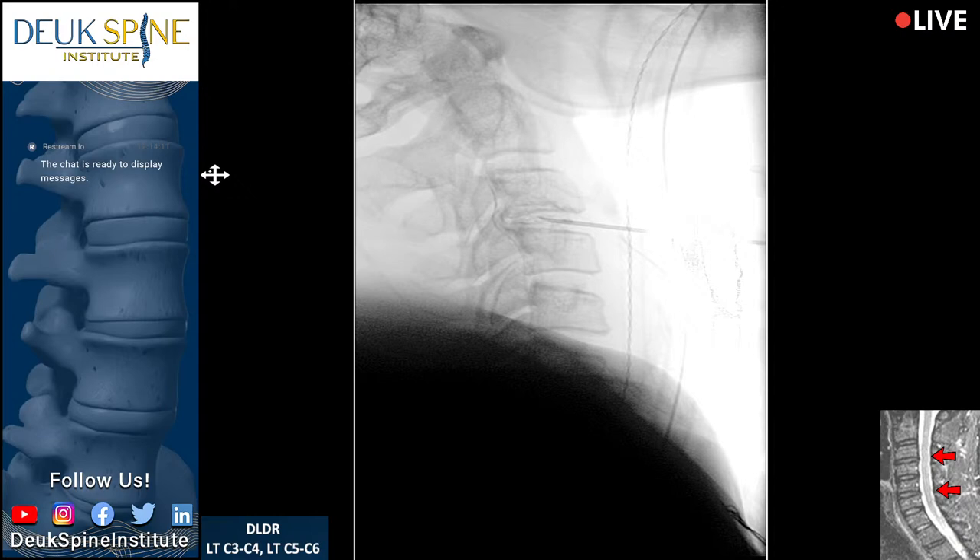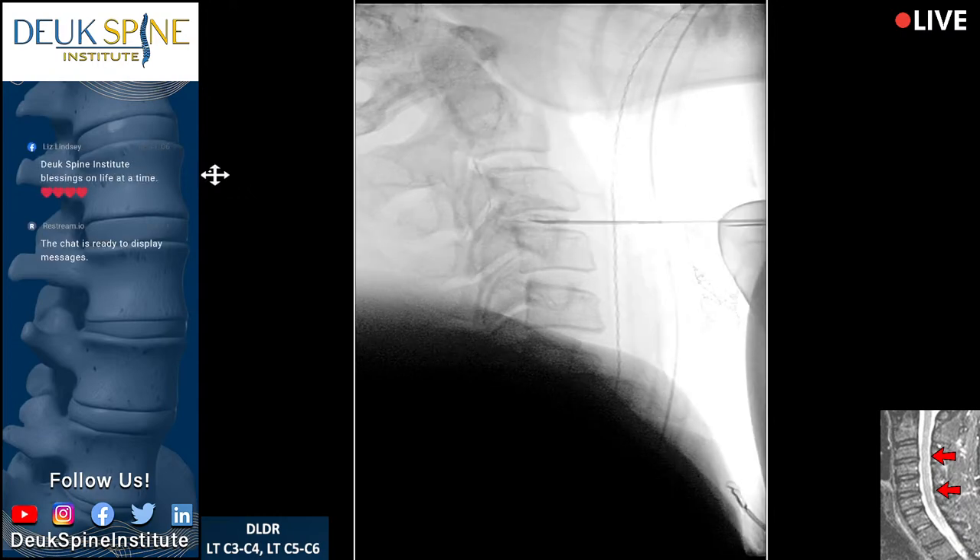That's actually a lot worse than what the MRI showed. I need to put the needle in a little further so it doesn't pop out. We're going to come back to that disc later. Let me place the 5-6 because we're skipping 4-5 — there's no herniation at C4-5, we're going straight to 5-6. Most commonly our patients have herniations next to each other — usually 4-5/5-6, or 5-6/6-7 — but this patient has a skipped disc that's normal.